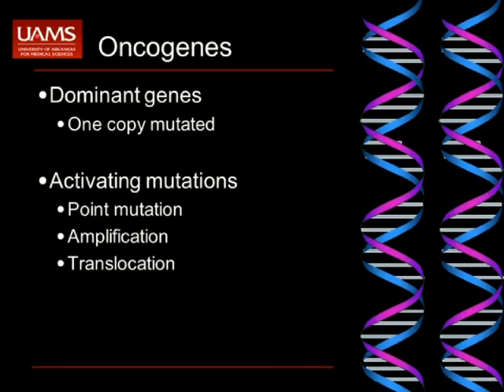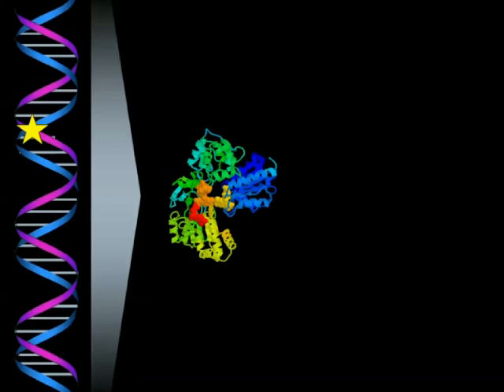And then lastly, most of us are familiar with the story of KRAS and BRAF in colon cancer treatment, but we sometimes forget that one of the most important tests we do in colon cancer is detecting people who have hereditary disease. And microsatellite instability is a form of mutated DNA. It's a form of mutated DNA that's a consequence of having a primary mutation elsewhere, but it's certainly something else we like to detect at the tumor level as well. So we'll talk about all of these technologies in a bit of detail.